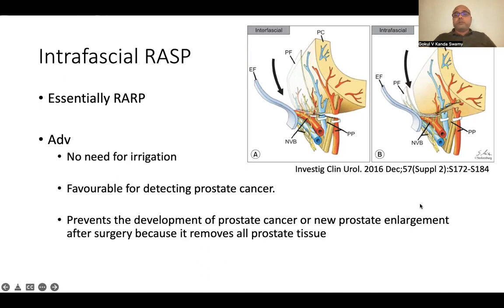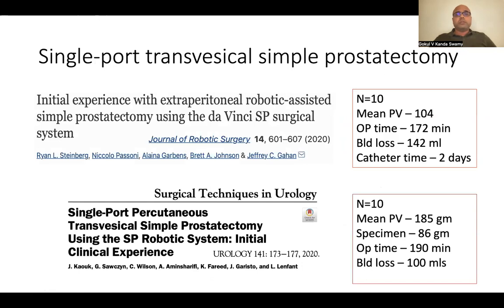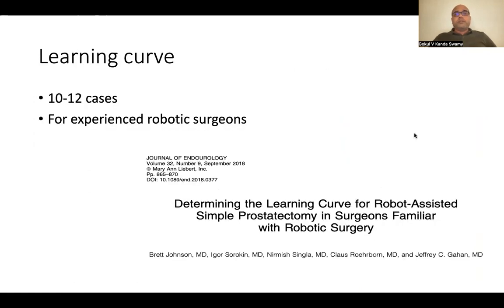And it was reported 5 years ago as one of the modalities of choice. The robotic platforms have even evolved, and even single port Da Vinci platform cases have been reported. Once again, if you look at all the numbers and the outcomes, they are very comparable to other surgical techniques. So clearly, even the novel surgical platforms do offer a treatment choice for these patients.